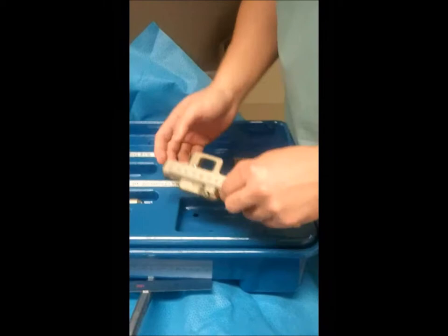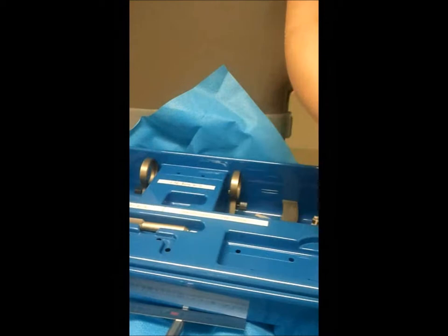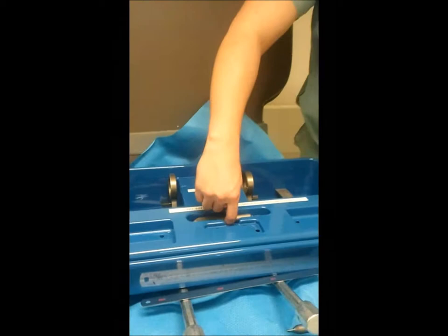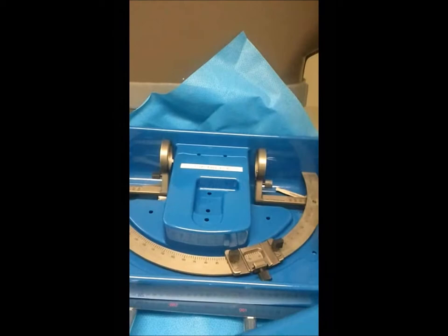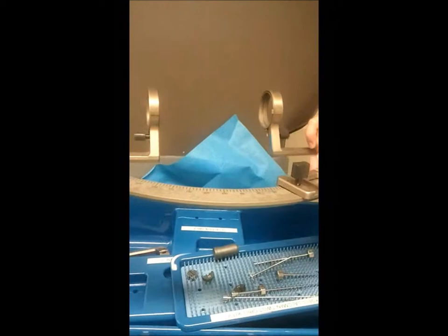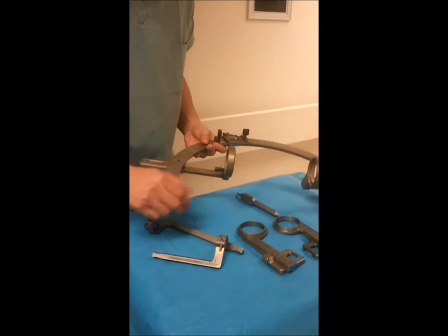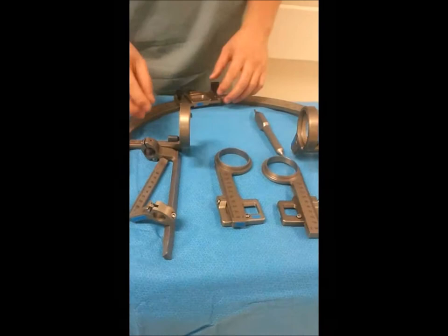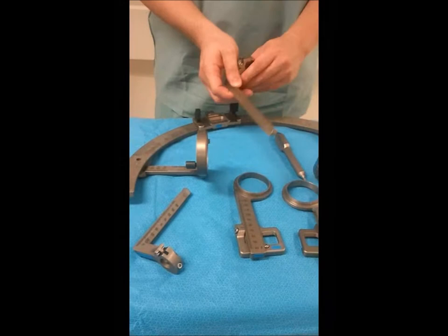Once we're done with that component and it's thrown off the field, the rest of these components should be sterile. These will be the two reference pieces that will determine our vertical, and also on this notch, our anterior-posterior location. We'll also want this screwdriver on the sterile field. There are two rings that we use for the DBS cases, which we should not need for these cases. And then you'll have the arc itself. On top of the arc are the two components that determine the depth of biopsy, and I'll show you how to assemble that shortly.